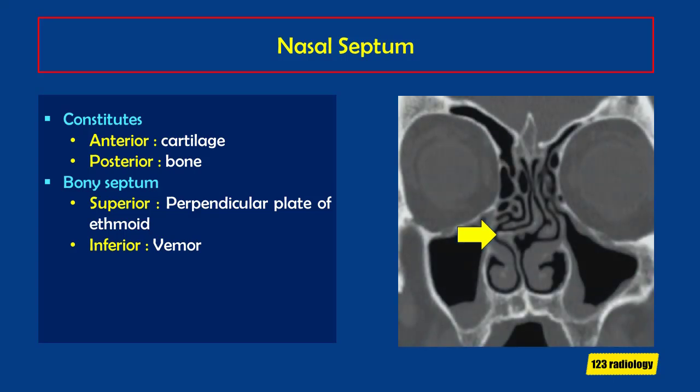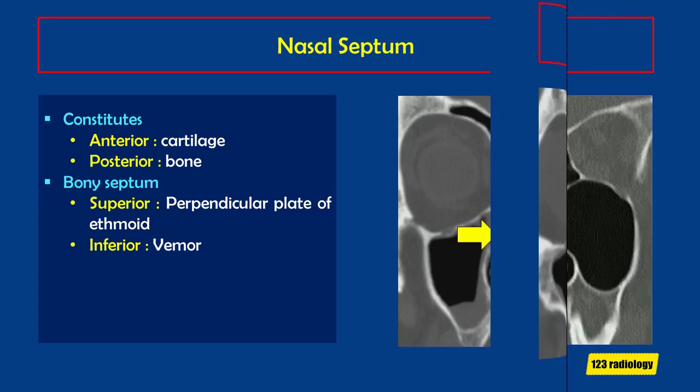One of the most common variants we see is septal deviation. Usually the deviation occurs at the junction of the cartilaginous portion of the septum and vomer bone, and is frequently associated with a nasal spur.